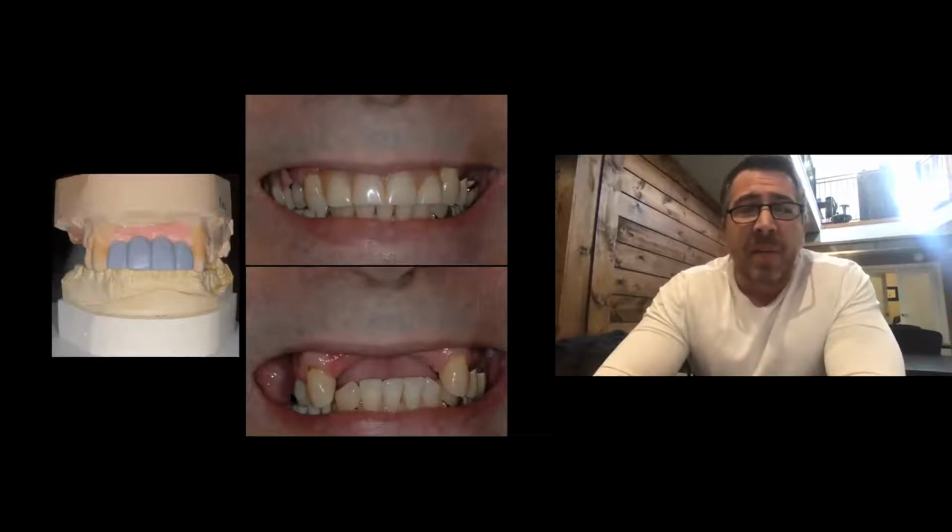But if you look at what a basic study model will show you, this is a case where what you're looking at is the patient wearing their denture for the 4 front teeth.